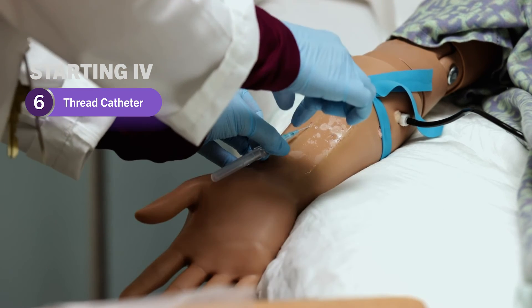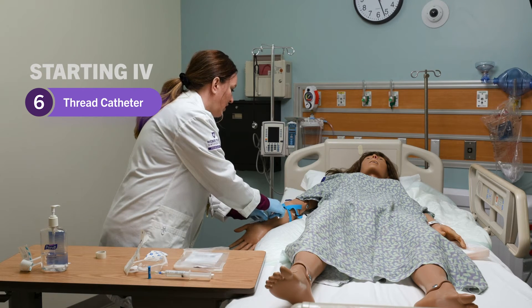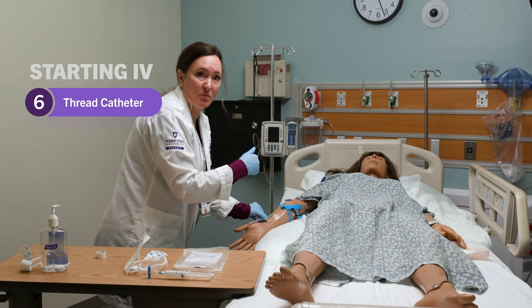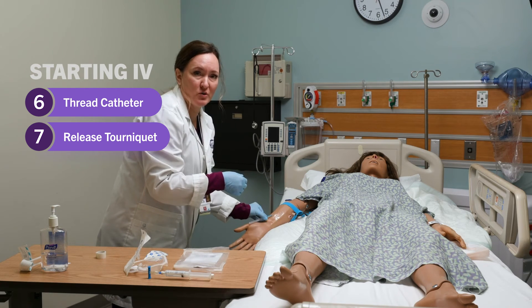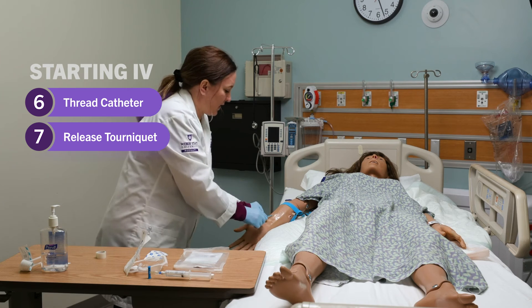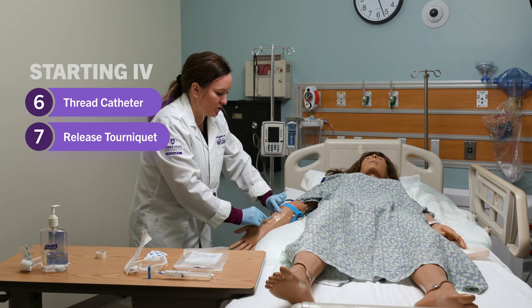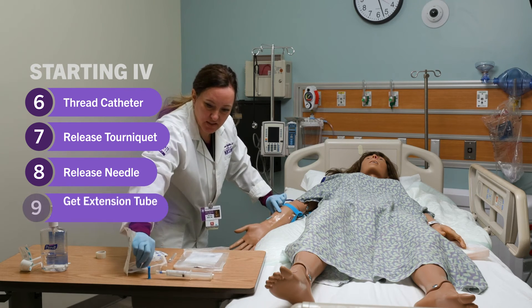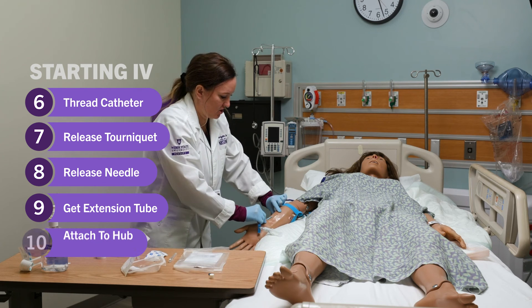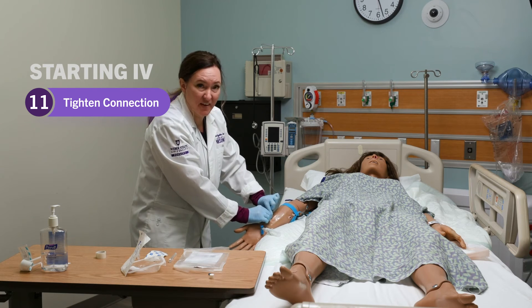I like to use a two-handed method, so I'll thread the catheter with my right hand all the way up until the hub reaches the skin. At this point you can release the tourniquet. If you're using a needle that is not shielded and doesn't have a one-way valve, you're going to need to occlude about where the end of the catheter would be. Then push the white button to release the needle. Get your extension, attach it to the hub, tighten your connection — all without touching the site.